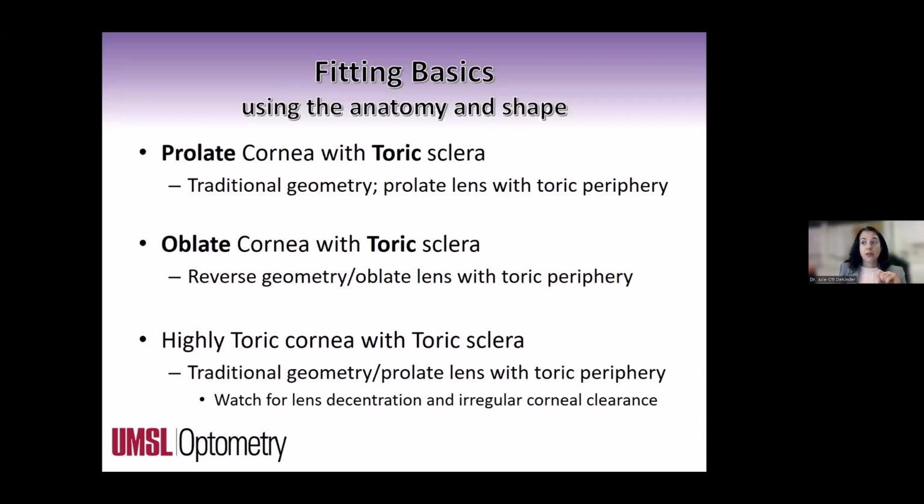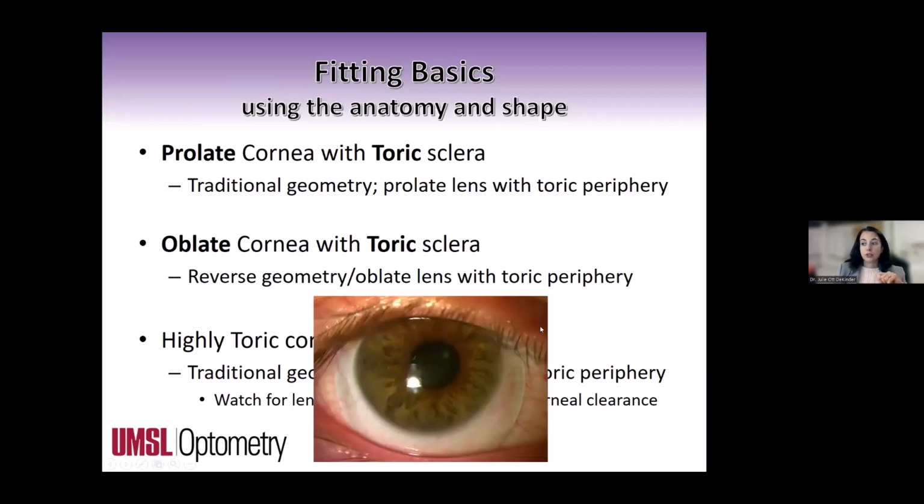And we're going to talk about that more here in a second, because that's kind of a big thing that I've noticed on several lenses over the last year. So if you see this, if you tighten your lens up and it's still looking nice and low like that, we're going to have to talk about something we've got to do to fix that fit, which is not just going to be messing with the periphery like it typically would.